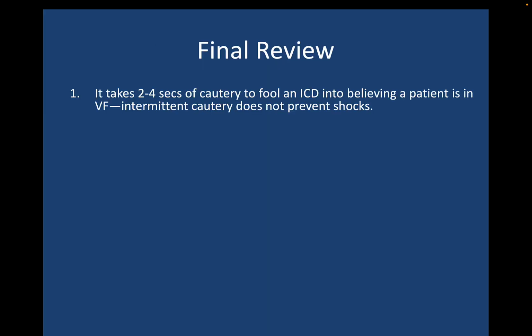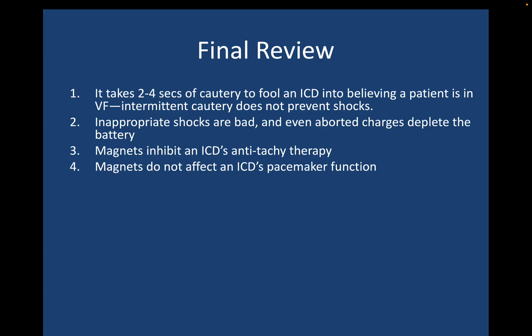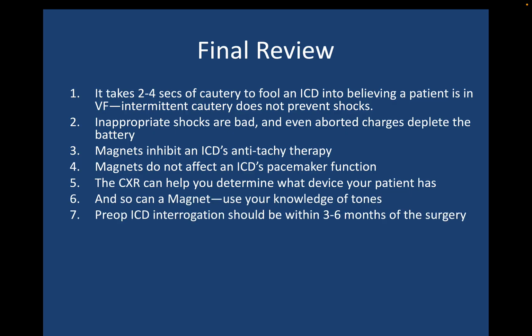All right, so final review. Number 1, it takes 2 to 4 seconds of cautery to fool an ICD into believing a patient is in VF. Intermittent cautery does not prevent shocks. Inappropriate shocks are bad, and even aborted charges deplete the battery significantly. Magnets inhibit an ICD's antitachycardia therapy, but magnets do not affect the ICD's pacemaker component. A chest x-ray can help you determine what type of device your patient has, and so can a magnet if you use your knowledge of the tones that are emitted.